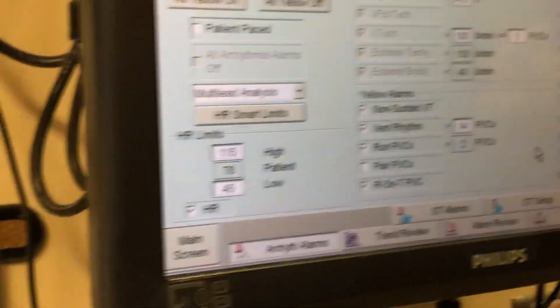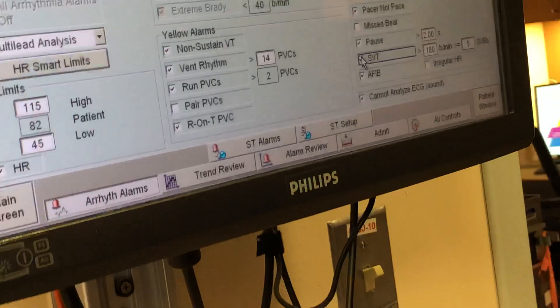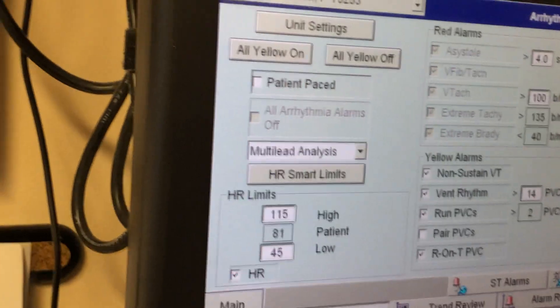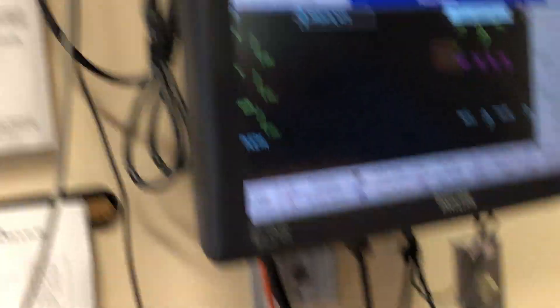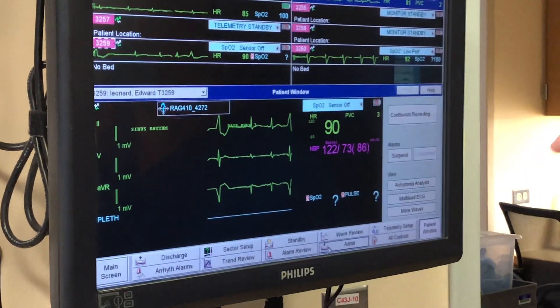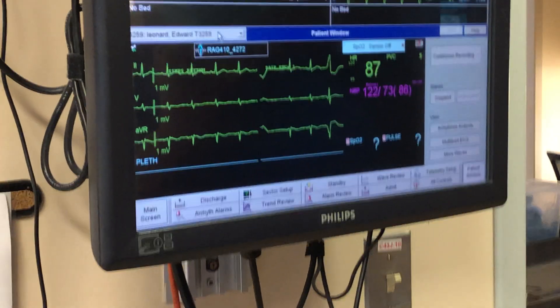All of these alarm when they're checked — if it's checked, it'll alarm when it happens. If somebody is paced, it comes in as checked for paced rhythm. When you admit a non-pacemaker patient, you want to make sure you uncheck the paced alarm. During admit it asks you if they're paced — make sure you uncheck it if they're not.